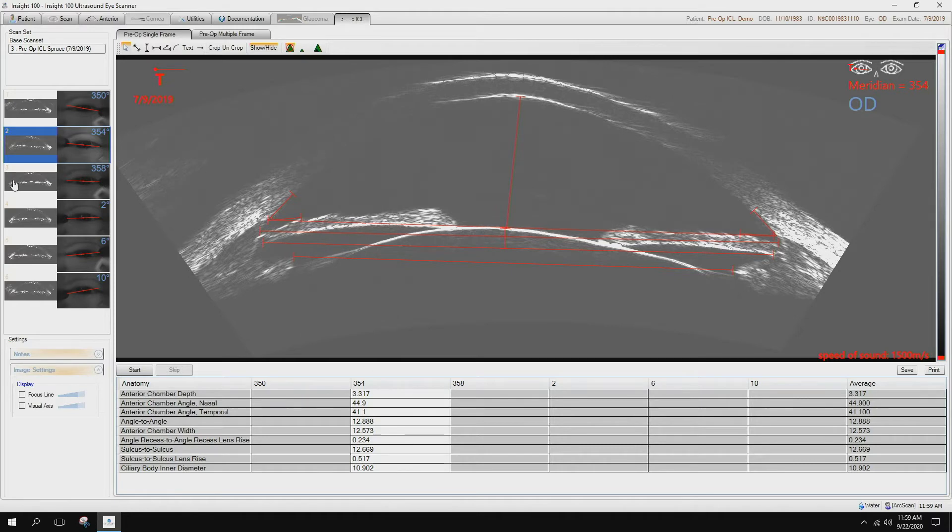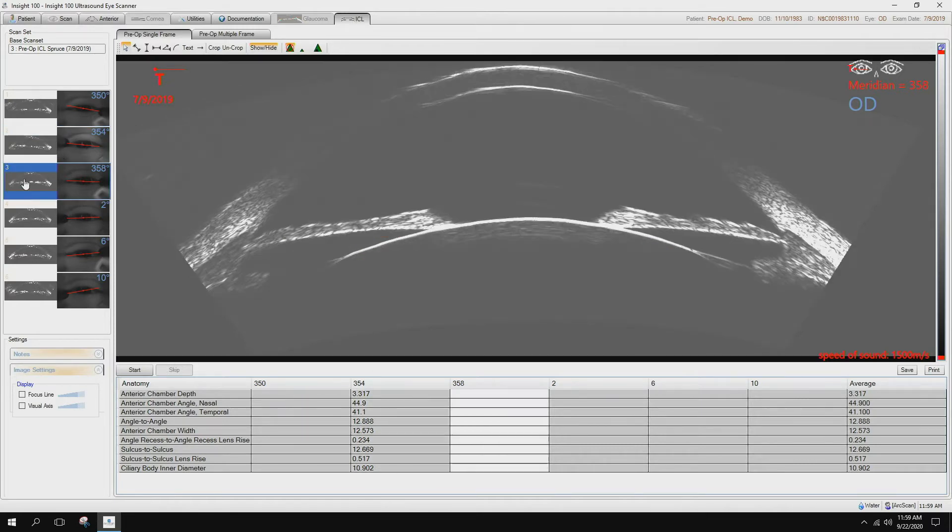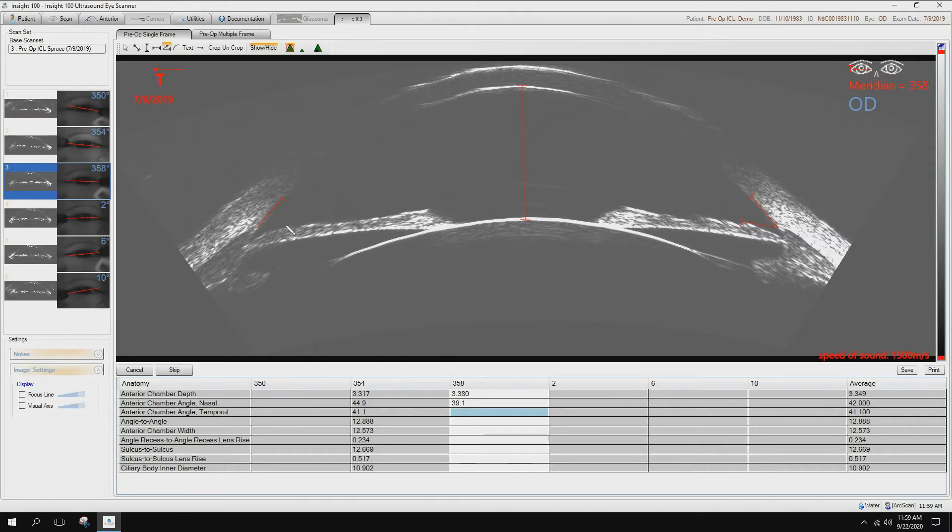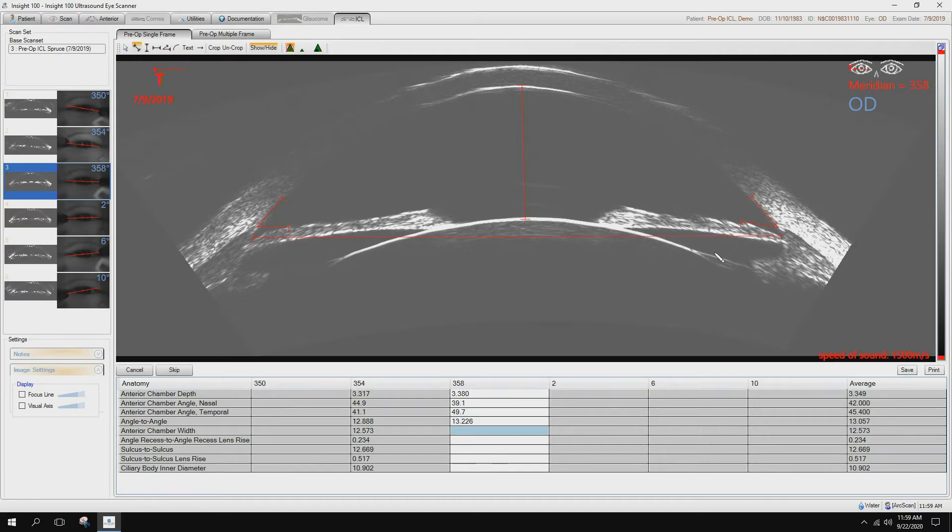We can go to the next one. And we'll follow the same thing. Start. Taking the angles. Angle to angle, the recess to the recess.